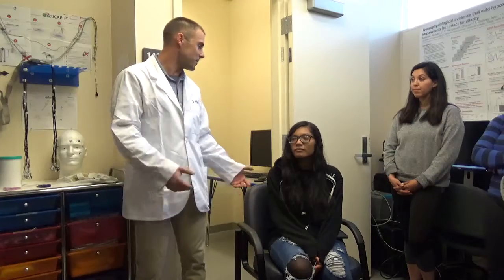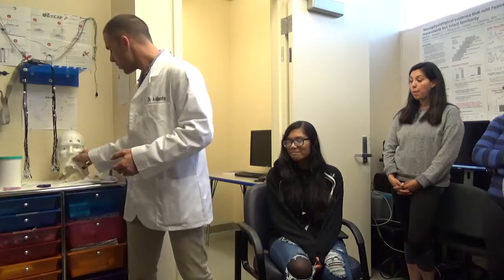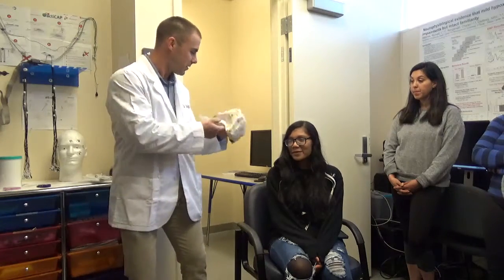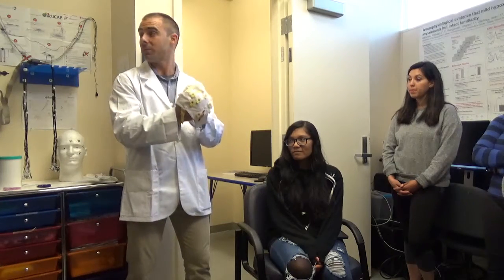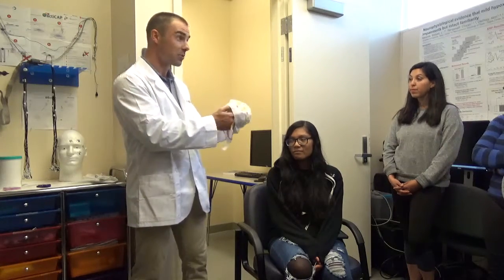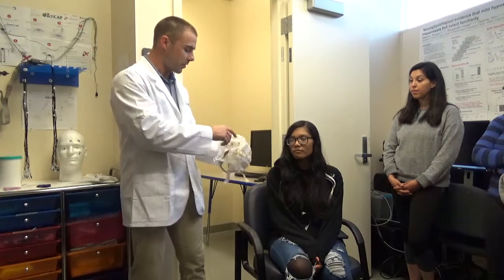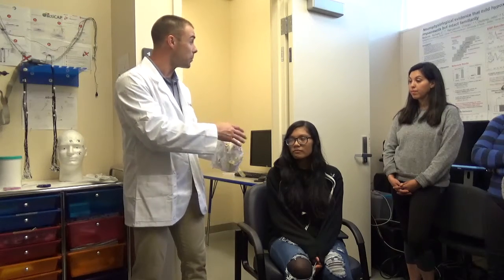So your job is basically to sit there and hang out, have good communication with us, and let us know if something bothers you, and that way we know to stop and change course. So what's going to happen is we are going to record some brainwave data, and we're going to put this cap on your head. Okay. So the cap, we explain, is essentially a shower cap. It's inert, there's no electrodes in it. It's just an elastic piece that's meant to hold the different electrodes in the same places for the same people.